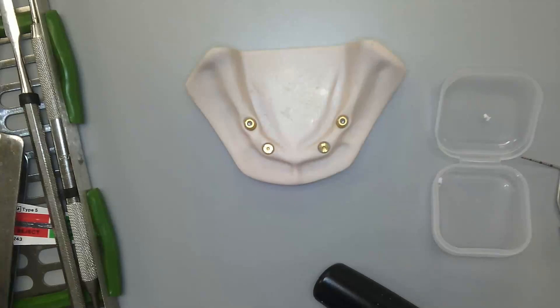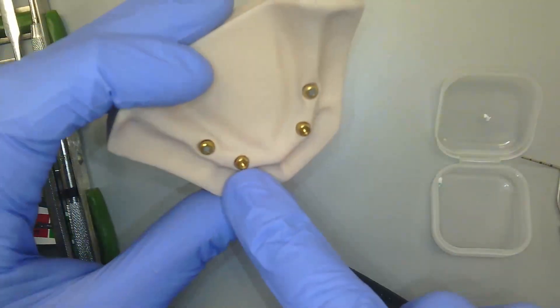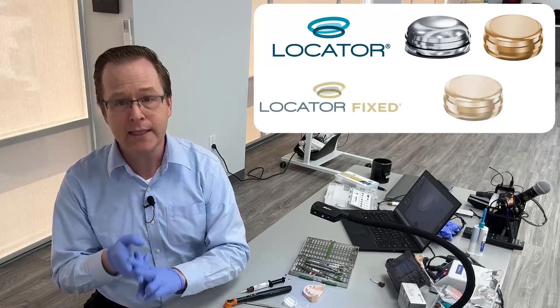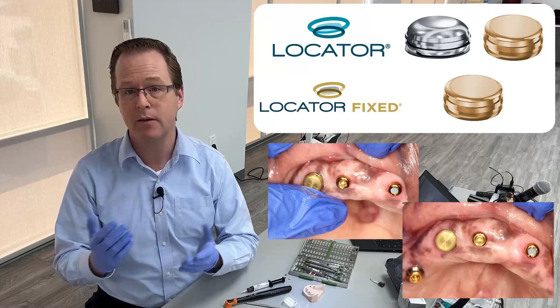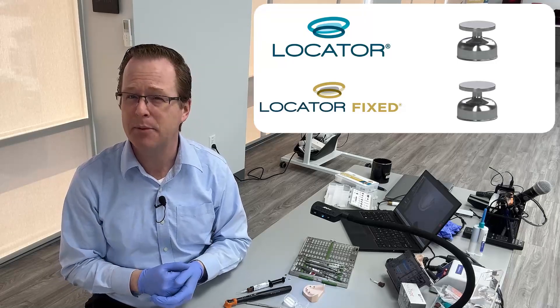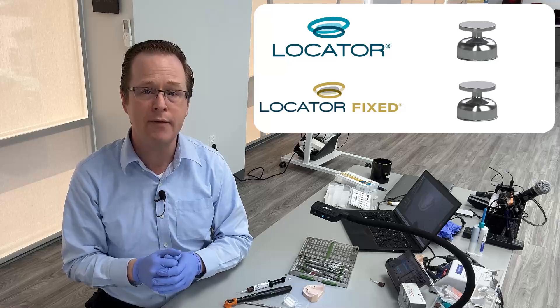Now that my curing light is finished, I have everything properly sealed. Notice that I've got my locator angled abutments with bulk easy plus material covering the posterior implants, and nothing covering the anterior — since those are the standard locators and the back ones are my locator angled. It's also a good idea to double-check that you have not overfilled the top of your locator angled abutment with composite. A good way to do that is to take a housing for either your removable or locator fixed case and snap it on top to confirm it goes all the way down. You can also use an impression coping to verify it snaps on. If it doesn't feel like you've got an audible snap, you may want to check for overfilling. If overfilled, you'll need to polish it down so your housing and insert can snap on properly.